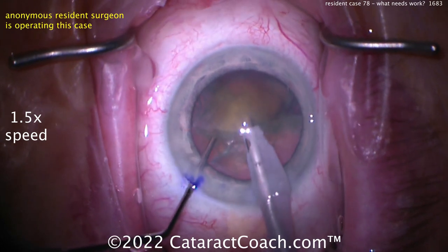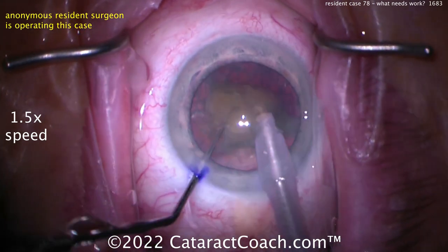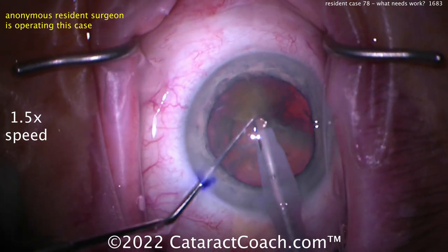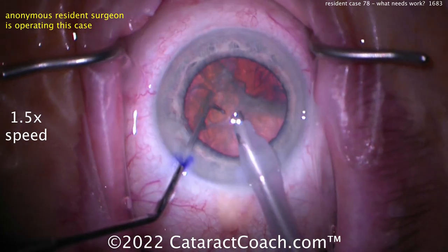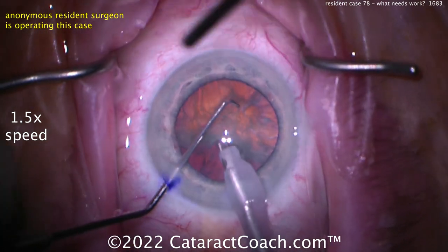Now being cautious, bringing that piece up with the chopper. I love how you're using both hands together in the eye — really great coordination here. And I can see the attending keeps squirting the eye. Wow, wow, wow — this is really fantastic. This new generation, I'm telling you, we're going to have great surgeons in the future.